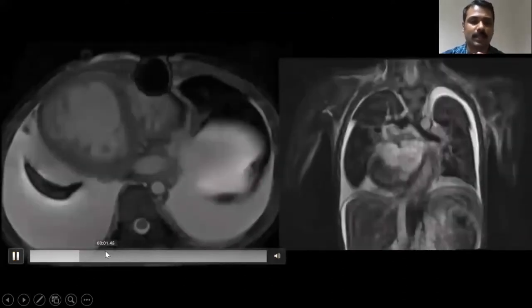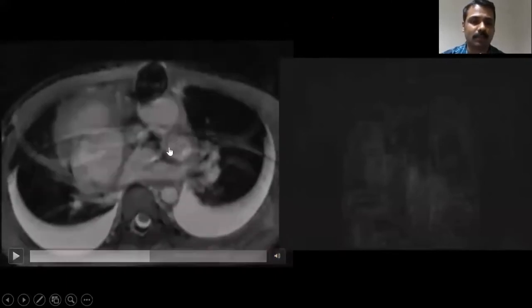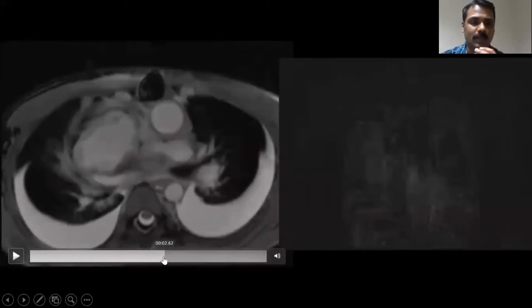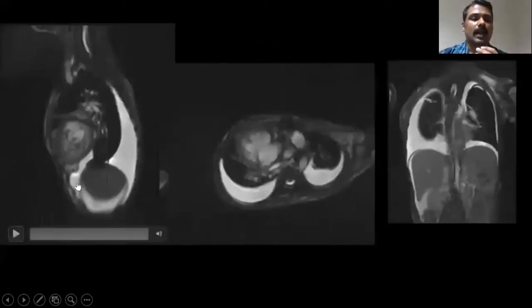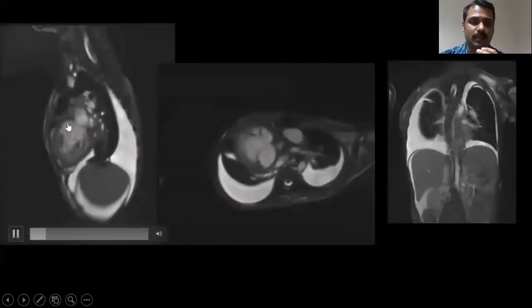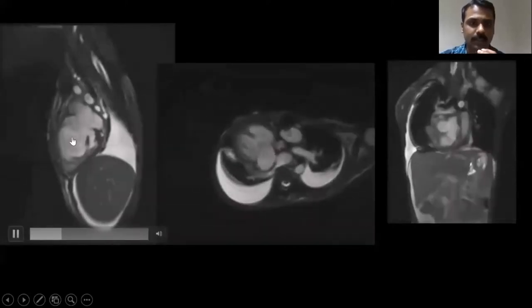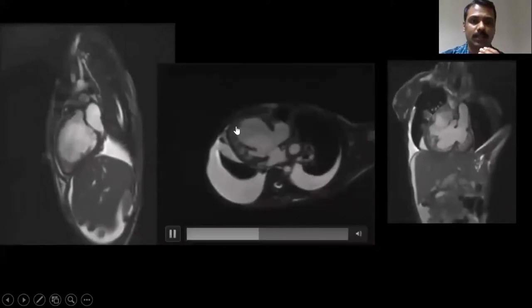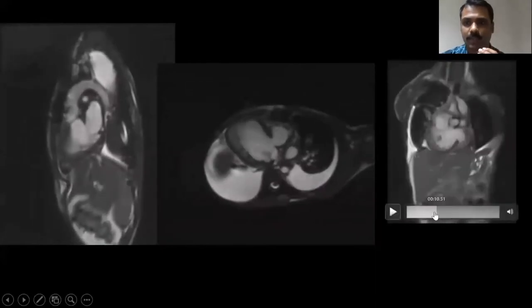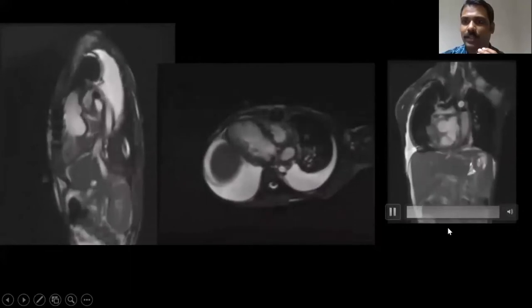MRI was planned for this case. White blood imaging is good for assessing intracardiac as well as Fontan circuit patency. The Fontan circuit shows good caliber with no focal stenosis, practically ruling out pulmonary embolism. The aortic root is of normal dimension, and proximal coronary arteries are identifiable. There is significant cardiomegaly and bilateral pleural effusion. Cine sequences in two-chamber, four-chamber, and coronal views show significant LV enlargement and global hypokinesia, with no significant thrombus and preserved wall thickness. There is also absence of turbulence in the Fontan circuit, which is reassuring.